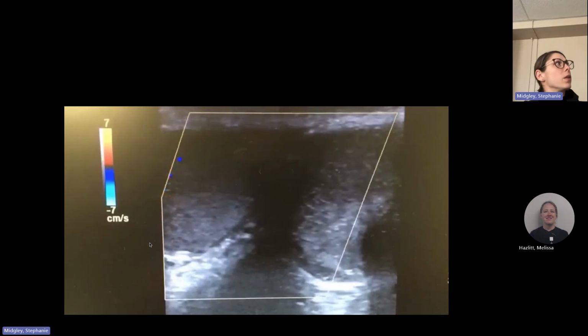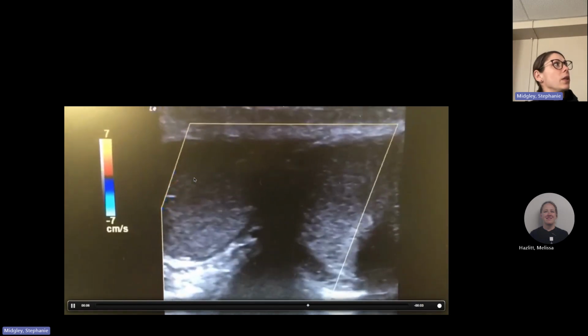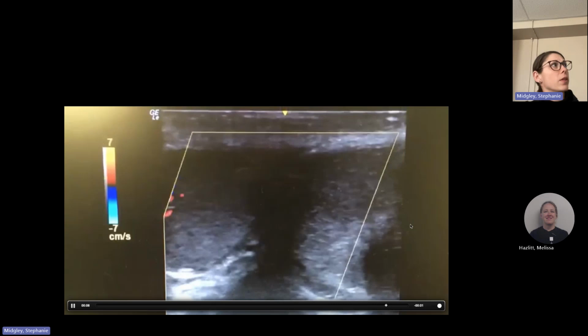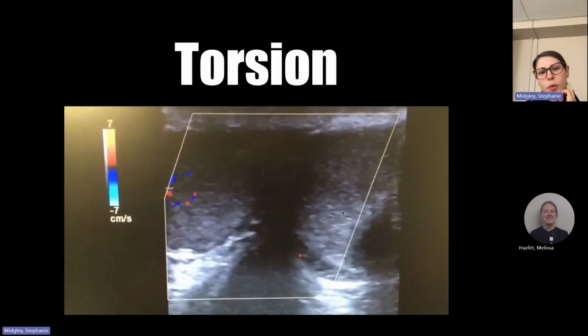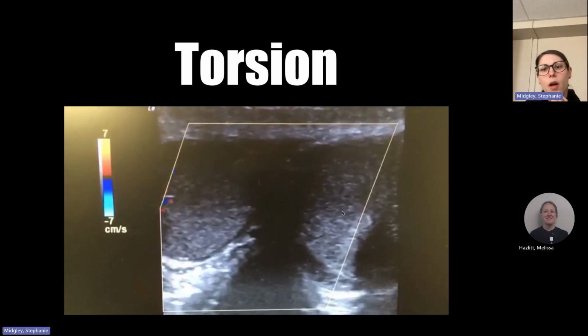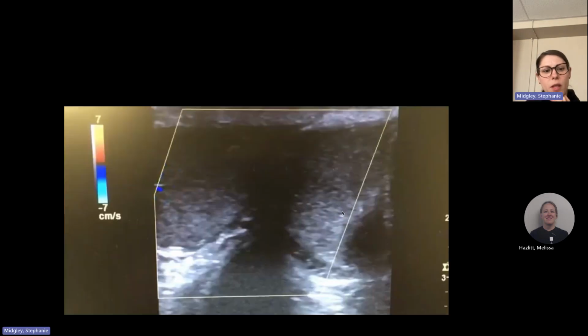So for this one, you can see that there's flow here, right? But when we compare it to this side, there's no flow. This is an example of torsion. So other things we look for with torsion, I'm going to jump back for a second. Most common on the left side. So most torsions happen on the left. And power Doppler alone shouldn't assure you that you do not have torsion. Just because you have arterial flow does not rule out torsion.